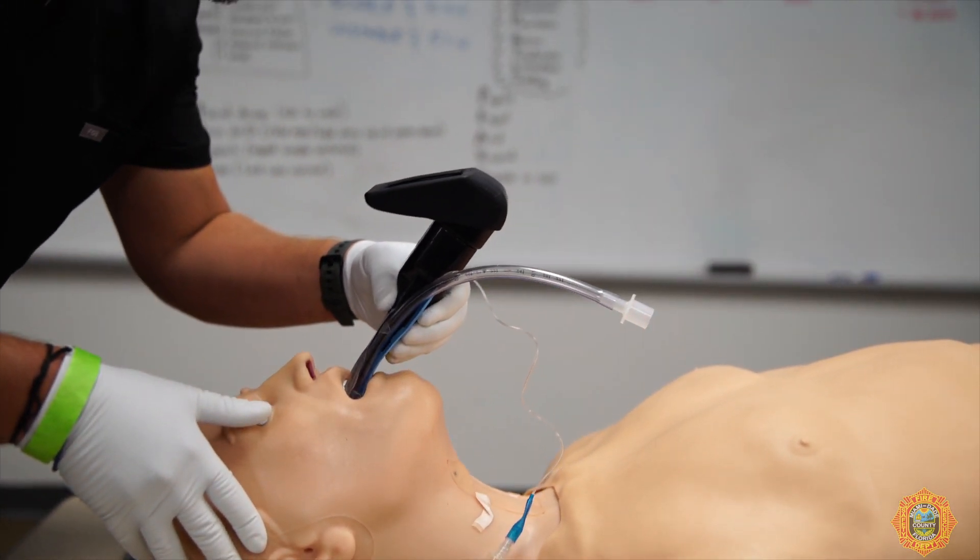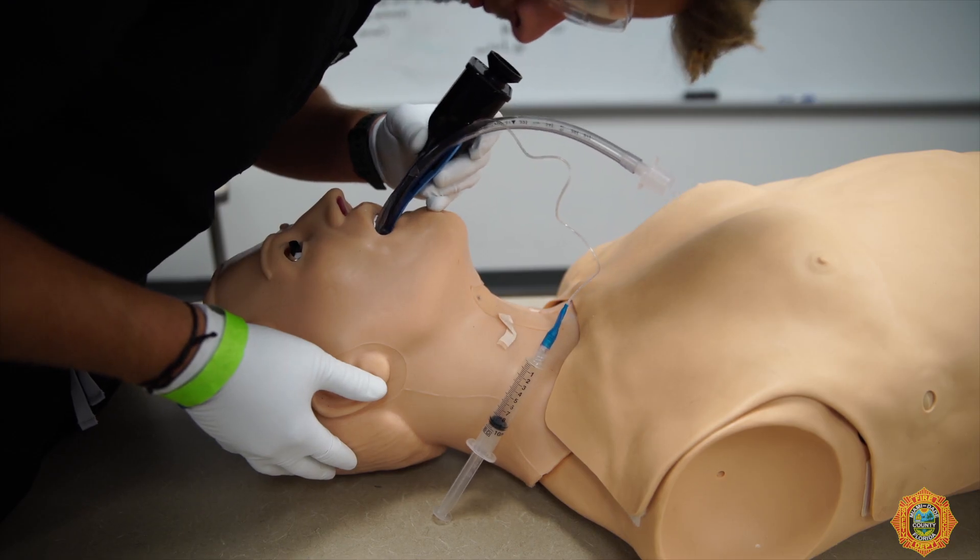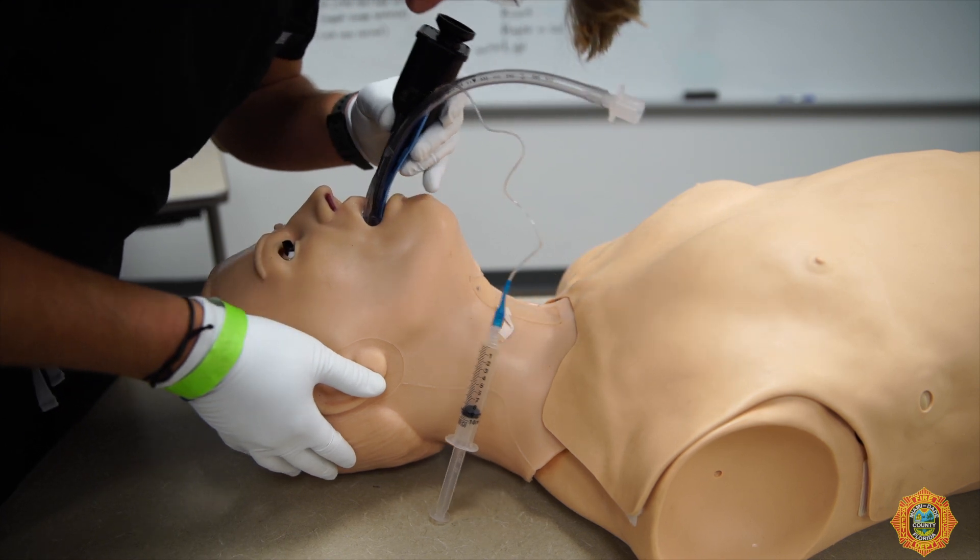Insert the AirTrack SP into the midline of the patient's mouth. Take special care to avoid pushing the tongue inside the oropharynx. Before it reaches the vertical plane, begin to look and identify the airway structures.